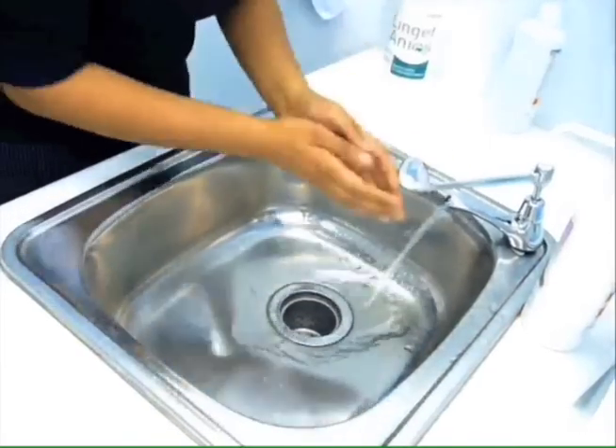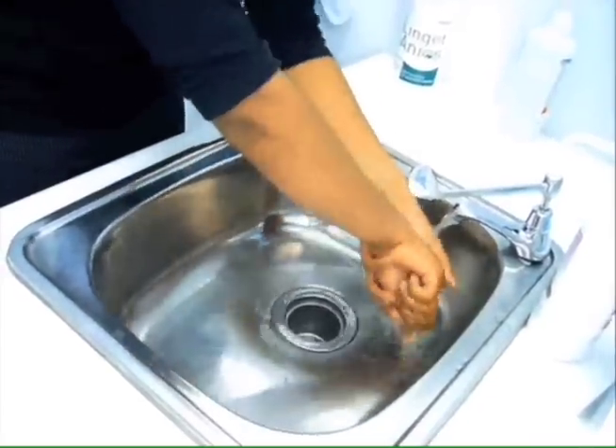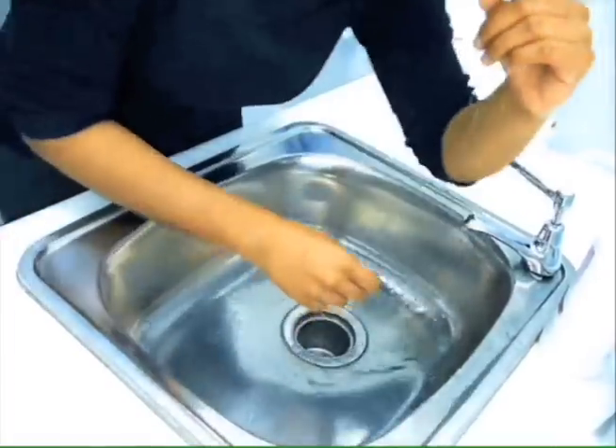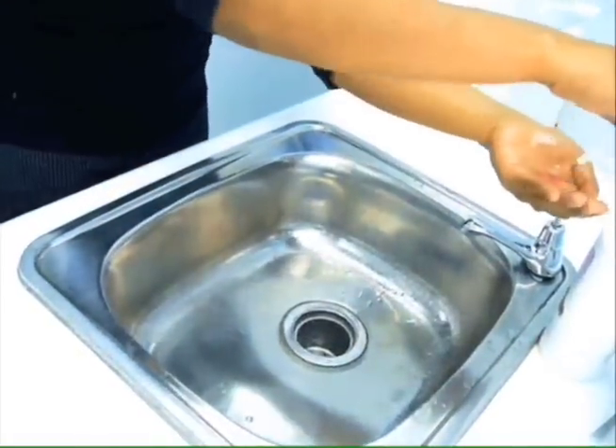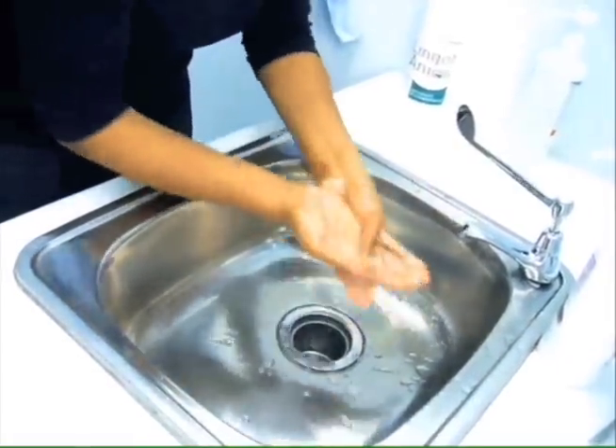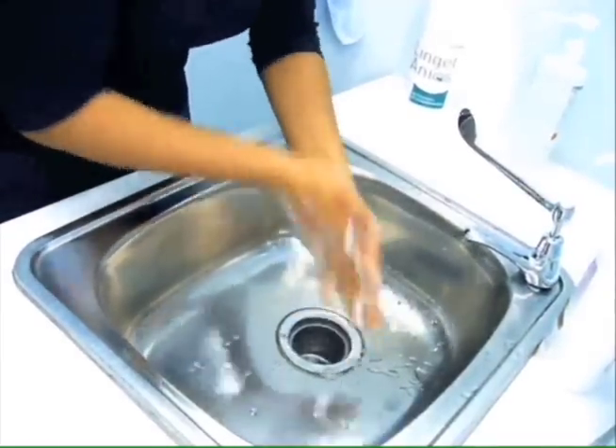Hand Washing Technique. Open the water tap with your elbow, wet hands and wrist with warm water. Use 2-3 squirts of liquid or foam soap. Lather soap and scrub hands well.